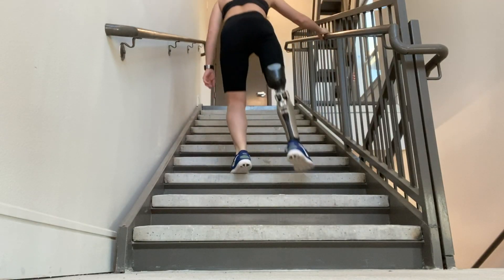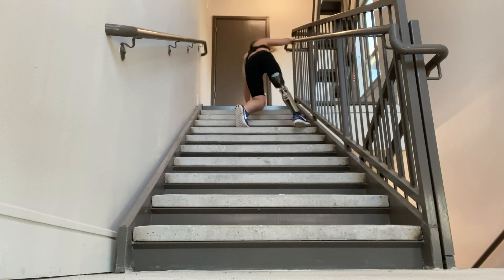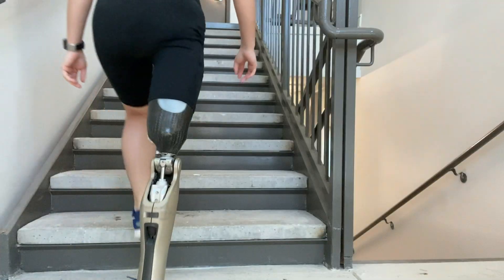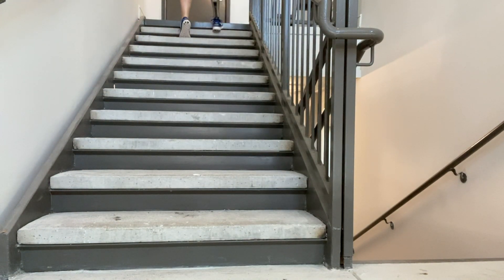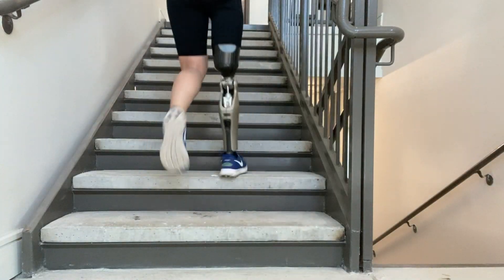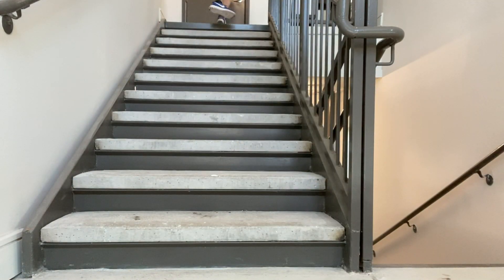I still do the one-hop downstairs some of the time, but for safety reasons, now that I'm getting a little older, I'm not as crazy about it. With going upstairs though, there are a few ways. My main two ways are going one up over the other — it looks a little different for me just because I can't really bend my knee in front of me like most people can, so I kind of have to swing it out to the side. The other way is to use the handrail and hoist myself up doing multiple steps at a time.